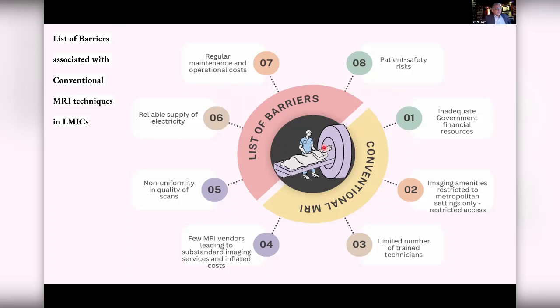So if you look at the conventional MRI and the portable MRI, a FLAIR in the portable MRI just takes 4 minutes. It's much quicker. You can roll it very easily. The interesting thing is that one can train, and we have data on it. And Altaf, who actually made this image, is preparing a paper for that purpose.